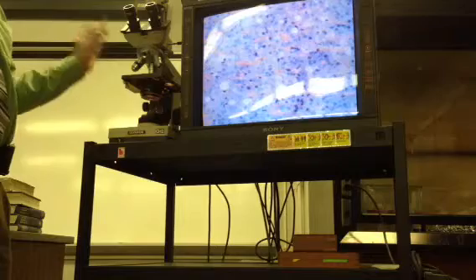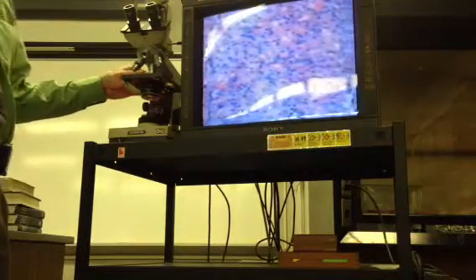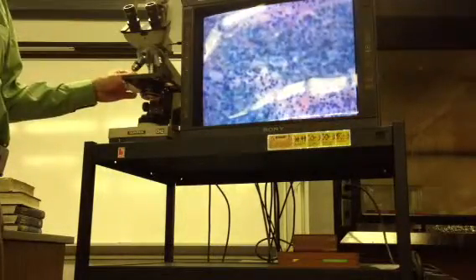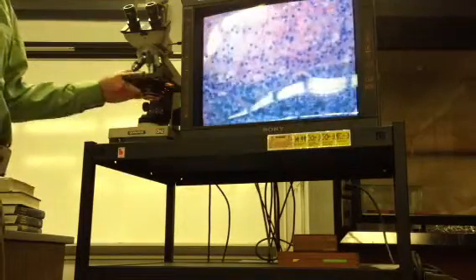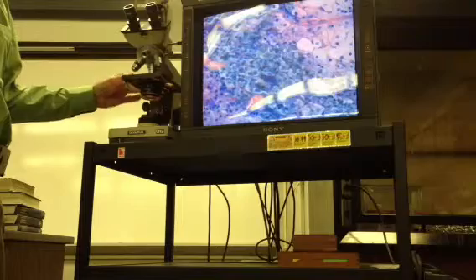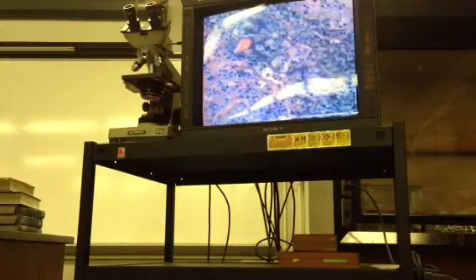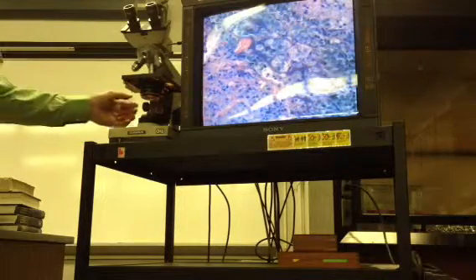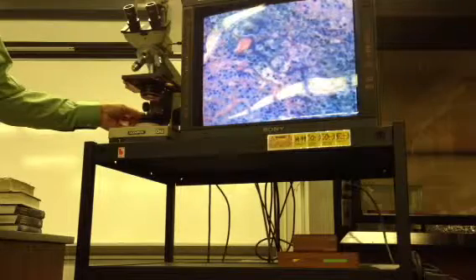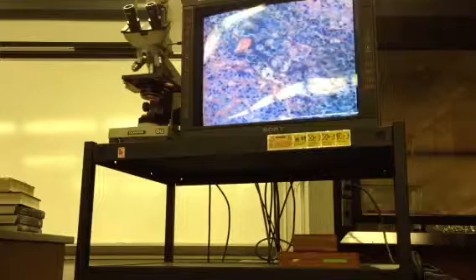So that's that. Did you get your picture? You got it. And the green color. The green is the medulla. Those are the chromaffin cells. Chromaffin, affinity for chromium, the cells are green. And those chromaffin cells make adrenaline or noradrenaline, epinephrine, norepinephrine, right?